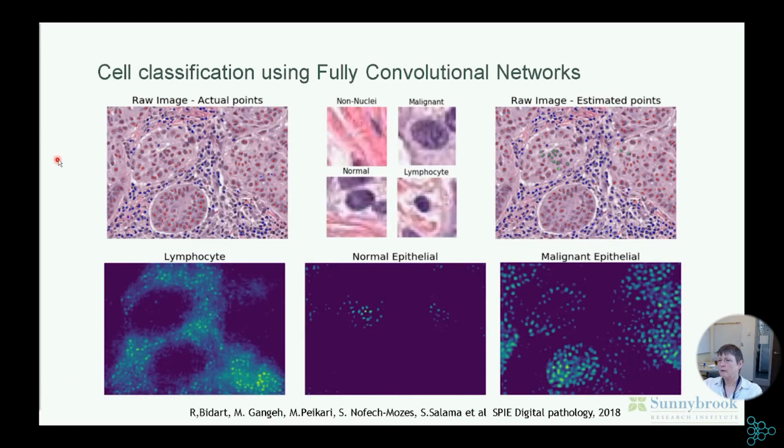That was an example of how we were doing patch-wise. Sometimes in digital pathology, we want to actually look down at the cell level. Now this becomes a kind of question of scale that we have a problem of. So this is an example of the annotations at cell level. So individual nuclei have been annotated here.